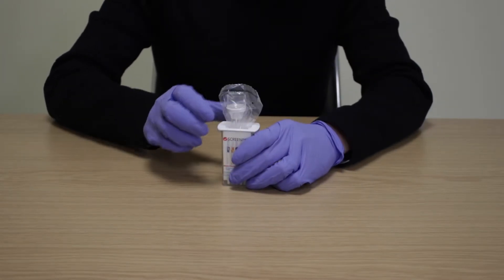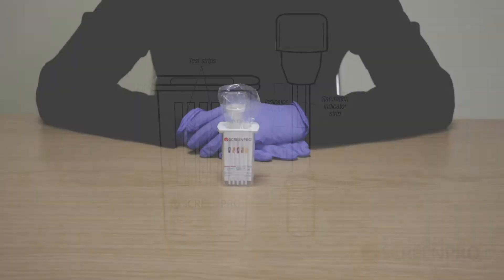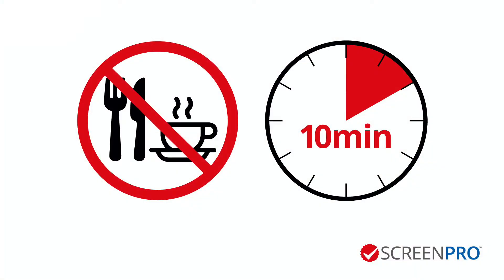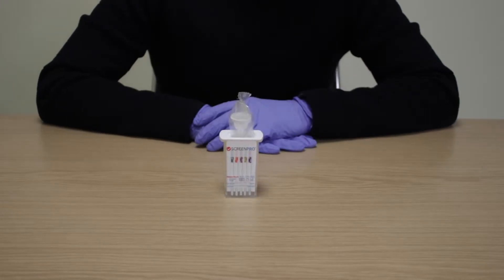Do not use the collection swab if the indicator is visible in the saturation indicator window. Important: donors should not eat, drink, smoke or vape for 10 minutes prior to a specimen being taken. Also instruct the donor not to bite, suck or chew on the sponge. Remove the collection swab from the pouch without touching the sponge and hand it to the donor.